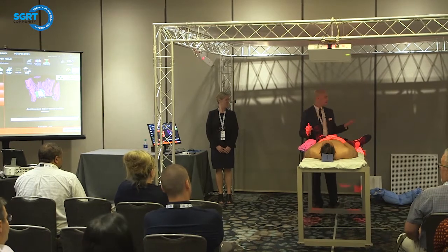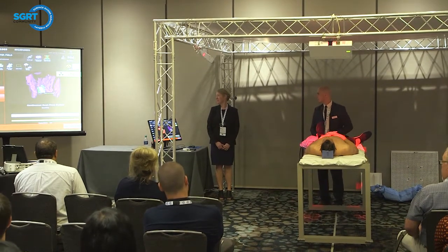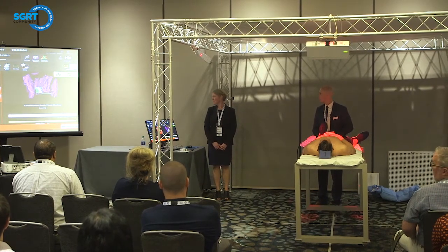Okay. All right, so go ahead and start it. So I'm just going to put him down into his back lock, try and get rid of that pitch, which actually worked really well. And I'm going to move the yaw just by moving the back lock left to right. I'm going to get everything less than 0.5 if I can.